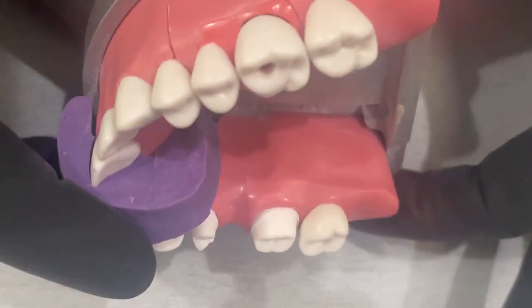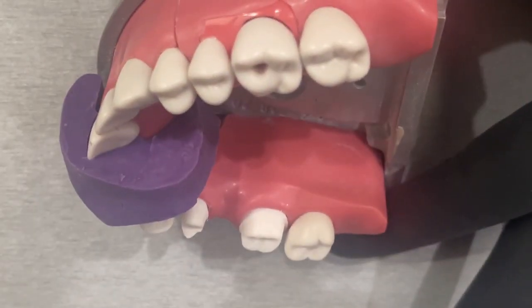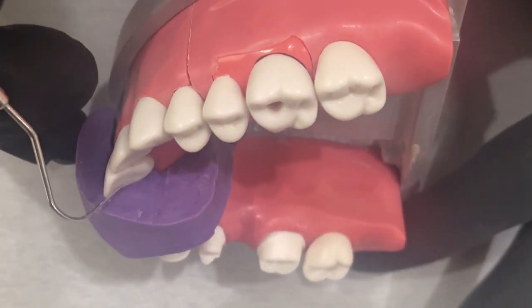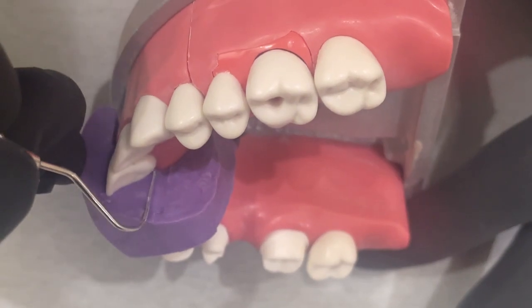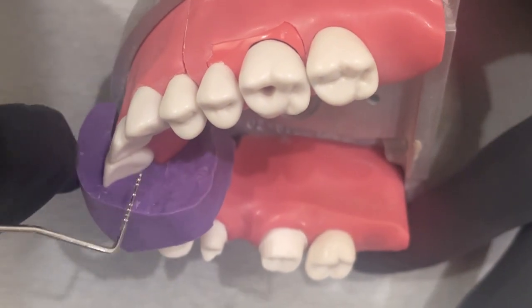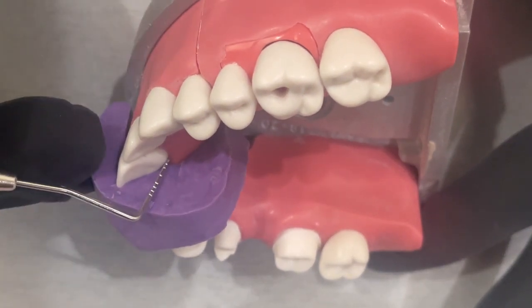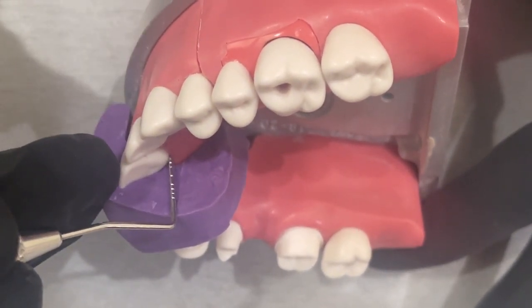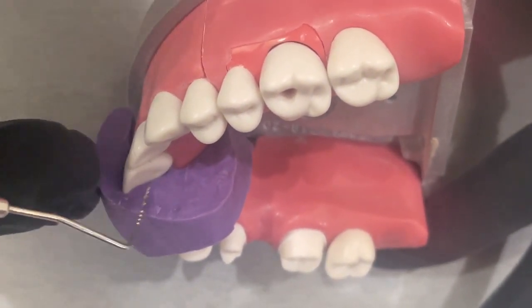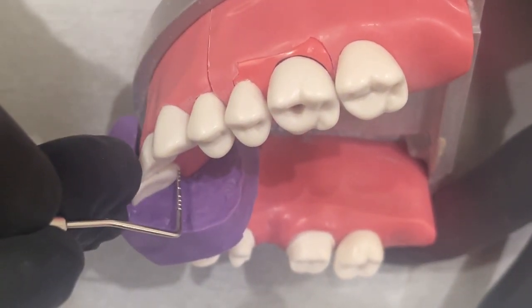Let's look at the cingulum prep for tooth number eight. The tooth itself doesn't even have a very good cingulum — it's already pretty flat. We do want to get at least a one millimeter wall right here. The bur needs to be held really straight up and down, almost going against that angle, just trying to force the creation of a wall, because the tooth itself is like a slope but we want a wall here.